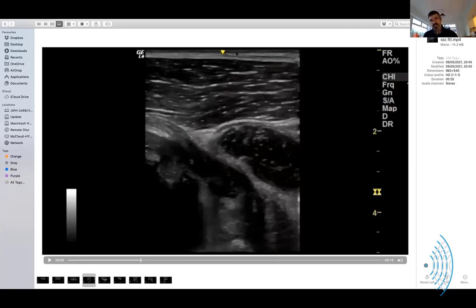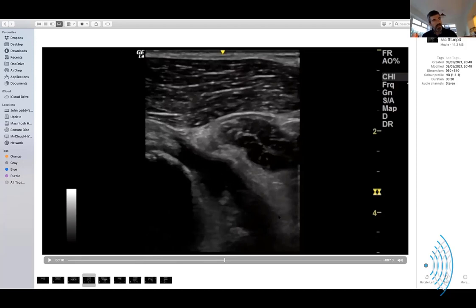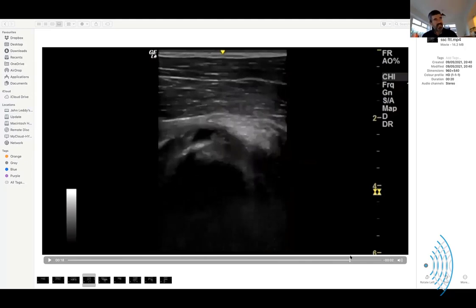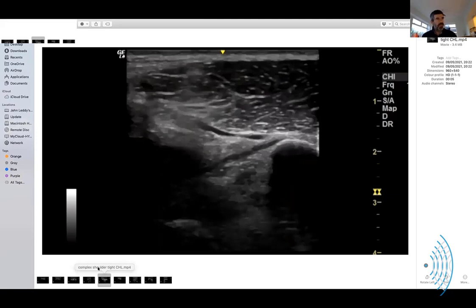So this is coracobrachialis here. There's the short head of biceps there. And so we're coming up to the coracoid, and there's bone. Wow. Fluid. And so he's lost his subscapularis, but it was very messy. I had real trouble making sense of it, which is why I saved the case. It's there. That also explains the medial translation of the long head through the groove a little bit, yes? Yeah. Though you see that often and it's not there.